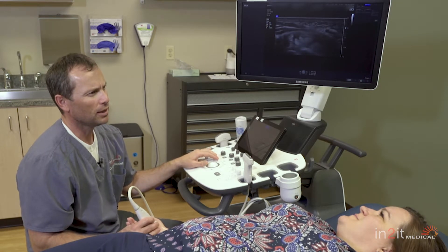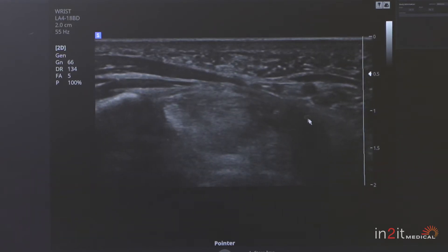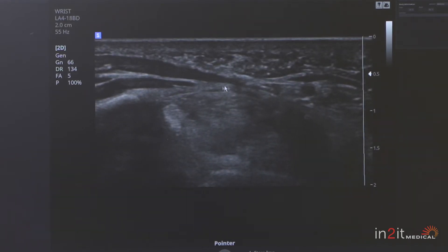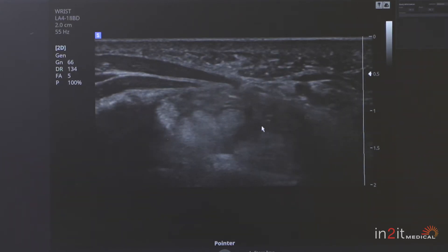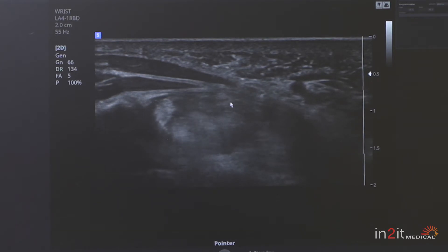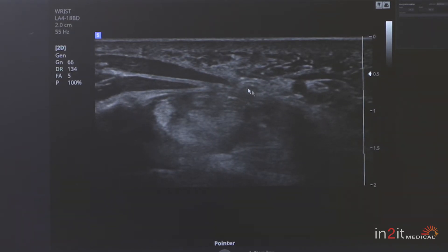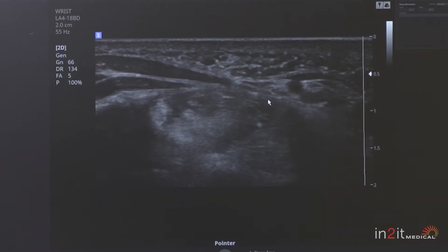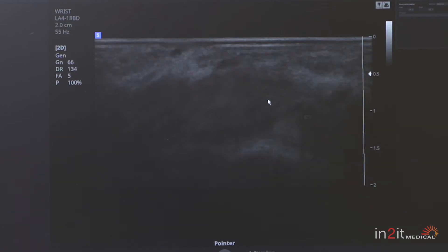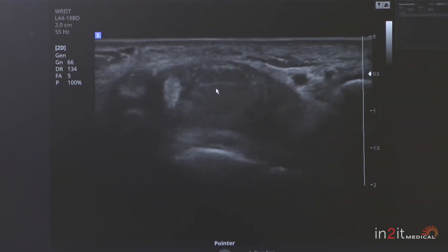If we go further down with this anatomy lesson, we can see the median nerve now underneath the carpal tunnel. We have this tunnel right here, this ligament over the top. These are all flexor tendons. If you move your fingers, you'll see these tendons moving and this nerve just kind of jiggling over the top. This is why carpal tunnel syndrome happens — your nerve swells up in a space that doesn't change sizes. In order to fix this problem, we just transect or cut this ligament, which allows the roof of the tunnel to open and resolve your symptoms.